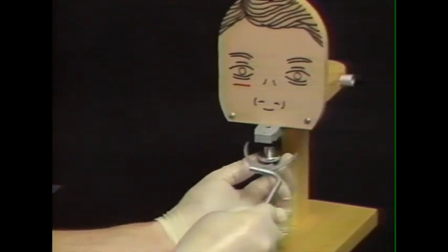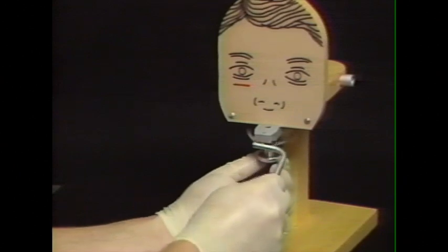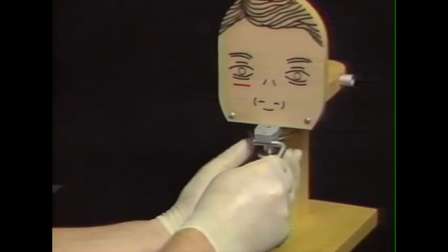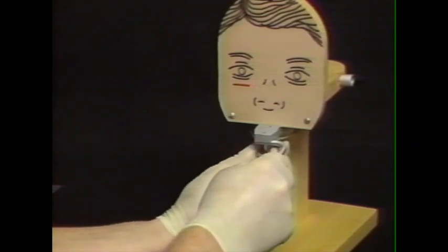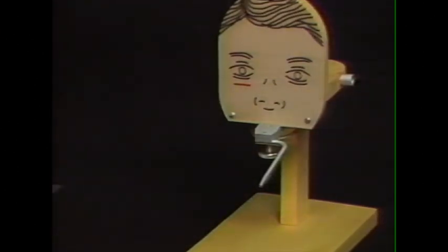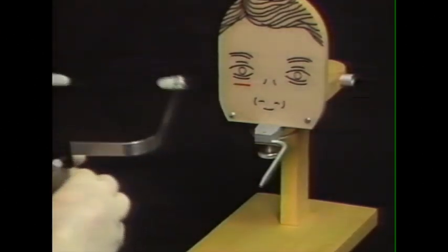Place that into Harvey. This simulates the use of compound or wax as a registration medium to relate it to the maxillary teeth. And we're next ready to apply the Facebow.